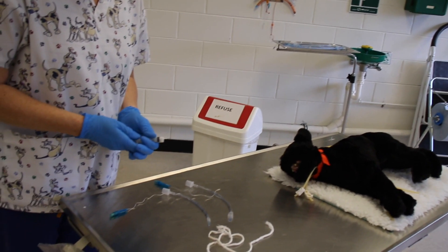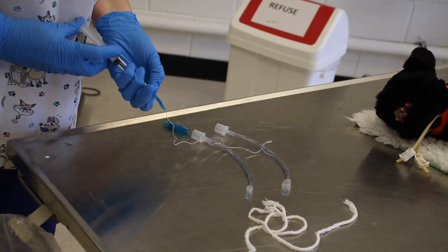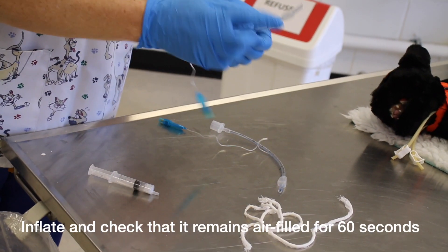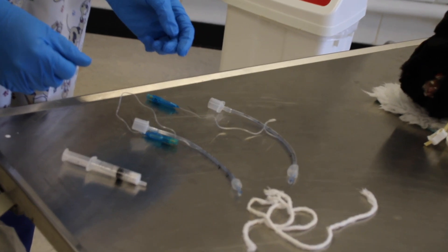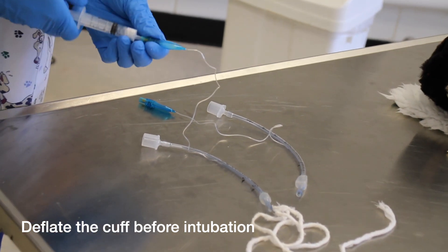Now I'm going to check the patency of the cuff. I inflate the cuff and check that it's inflated all the way around. You leave it for about a minute to check the cuff stays up. Then, before you intubate your patient, you have to deflate the cuff again.